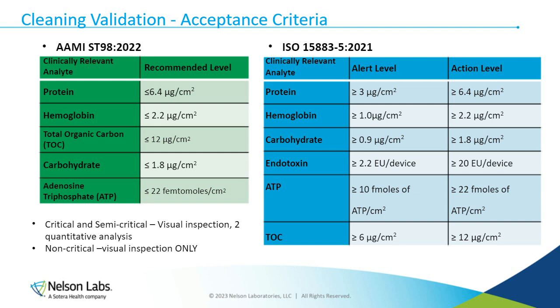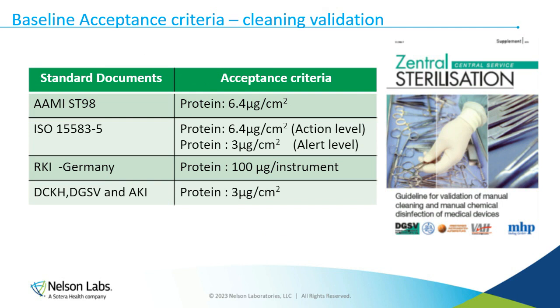But that's all there is to that. Now, one thing to remember is there are different criteria in different countries. And so you want to make sure that you're using the right criteria for the right country.